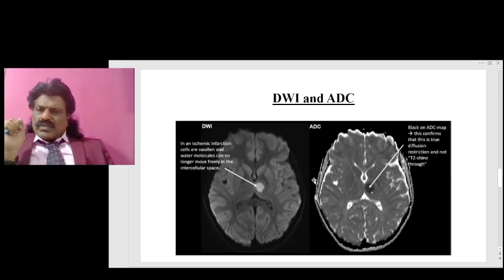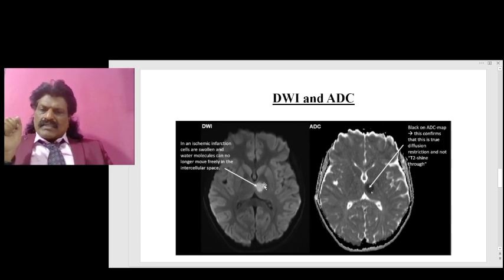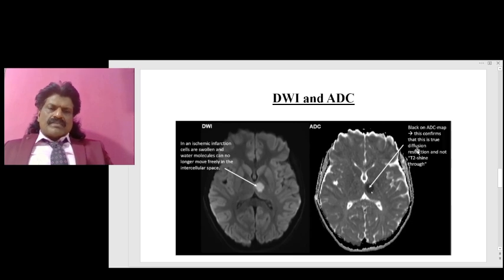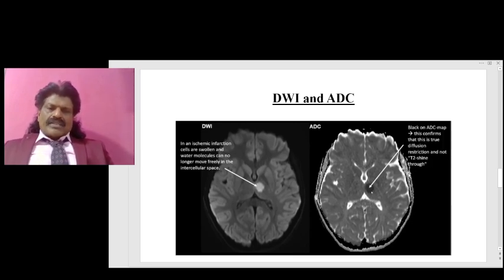In an ischemic infarction, cells are swollen and water molecules can no longer move freely in the intercellular space — appearing black on ADC. This confirms that it is true diffusion restriction and not T2 shine-through.